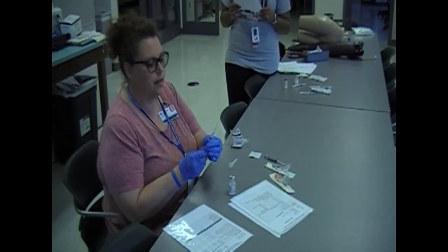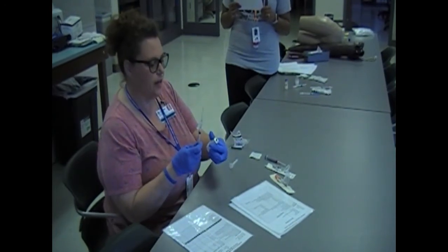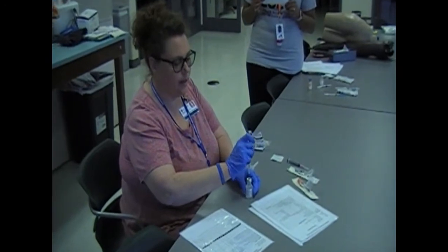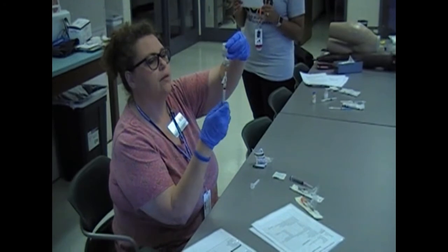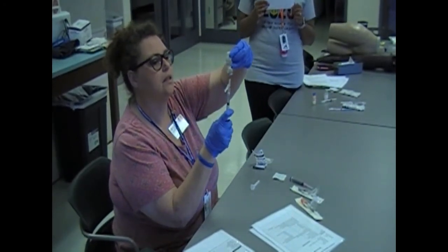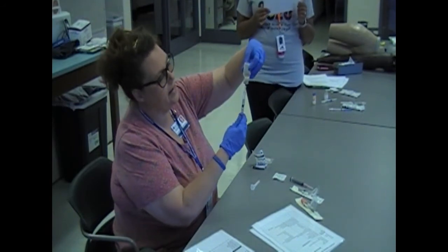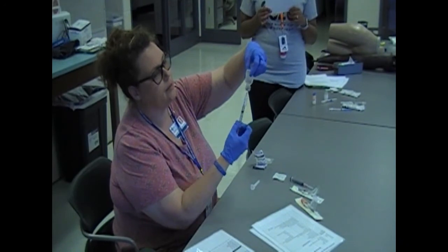And remember, just like on your PowerPoints, however much you're going to draw up, mine is 4 milligrams per 1 ml. So I'm going to insert 1 ml of air. I'm going to pick my vial up, get this where I can read it. Be sure to get out all your air bubbles from the syringe and make sure that top line of the plunger is directly lined up with the dosage ordered. Here's my 1 right here. I'm going to draw up just a little bit more to give me some room to get rid of my air bubbles.